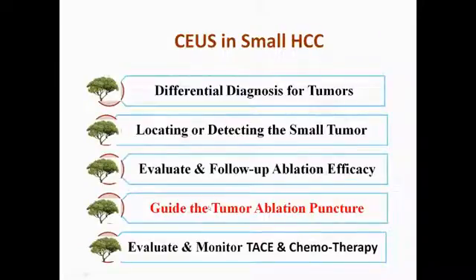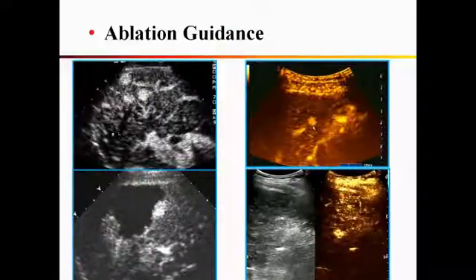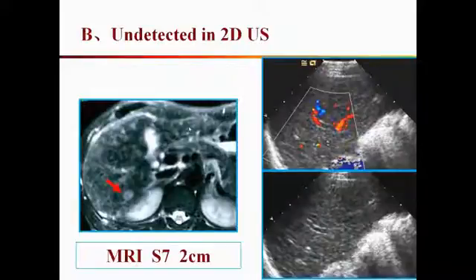And the fourth thing I'd like to say is that guidance for tumor ablation puncture is sometimes very helpful. I showed the picture for you; without contrast ultrasound detection, we cannot puncture the tumor, so it's the only way to display the tumor and puncture precisely.